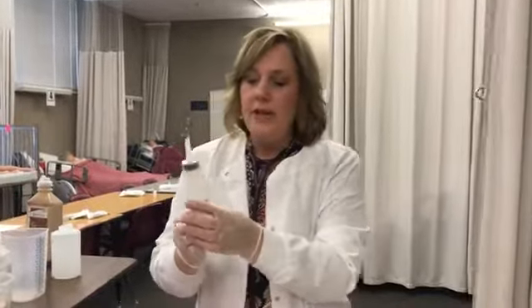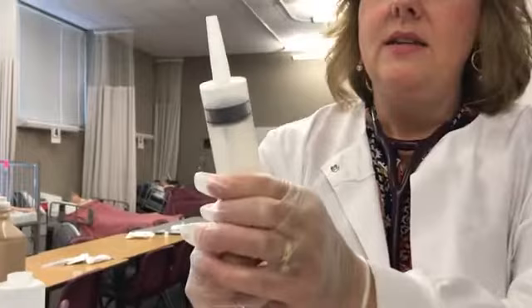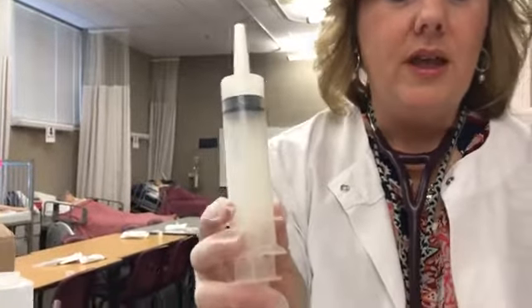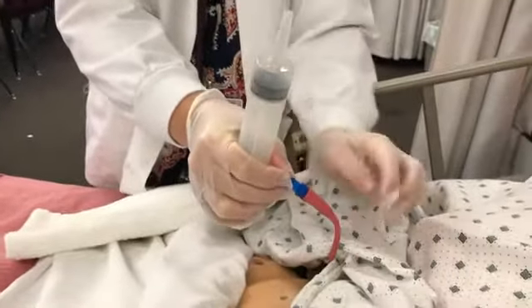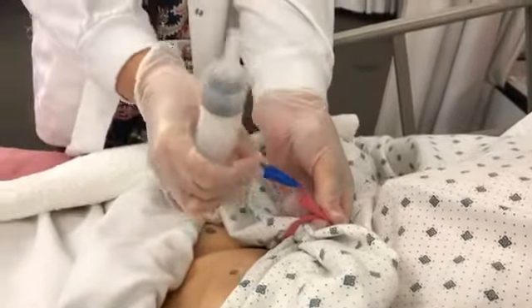Okay, I do hear active bowel sounds. So now what I'll do is check for placement. When you check for placement, I'm going to draw up about 10 cc's of air. You can draw up 10 to 30 cc's of air. And then I'm going to attach it to the client's peg. Now I'm going to clamp this off because I don't want any extra air to come into the site.